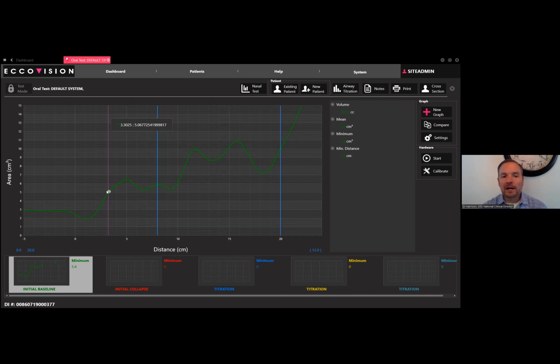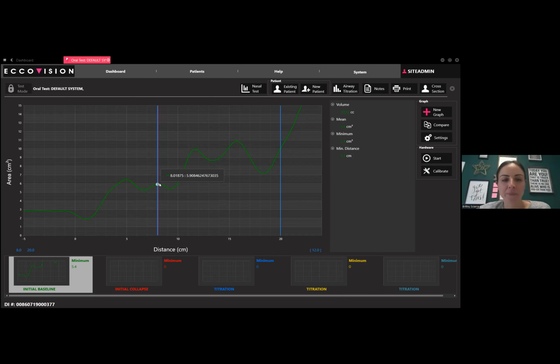And then you'll see a rise for the palatal vault, and then it comes back down as it hits the junction of the oropharynx. So I had tonsils removed. This is why I don't have my constriction at the oropharyngeal junction. We call it OPJ. If you look in my mouth, I'm a Mallampati 1.